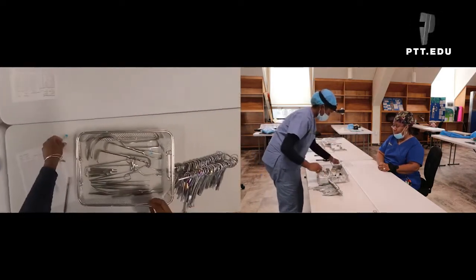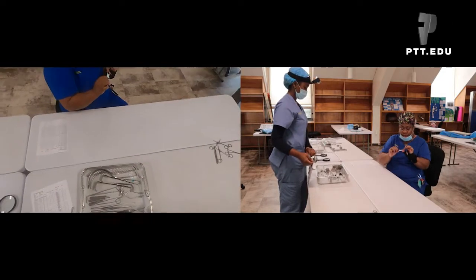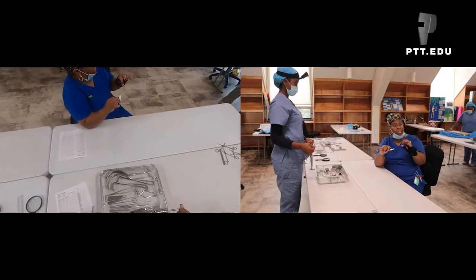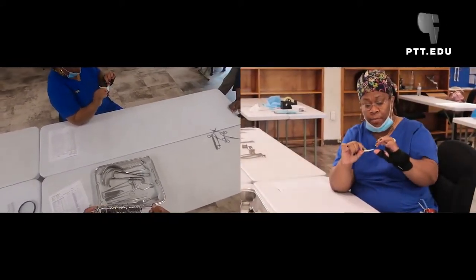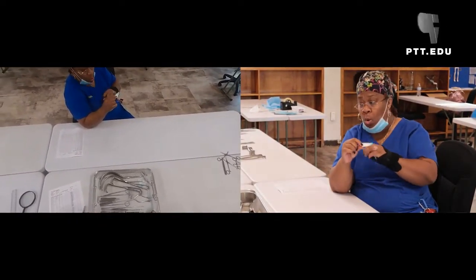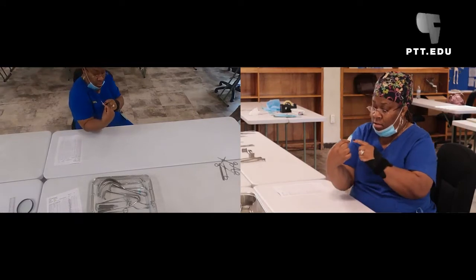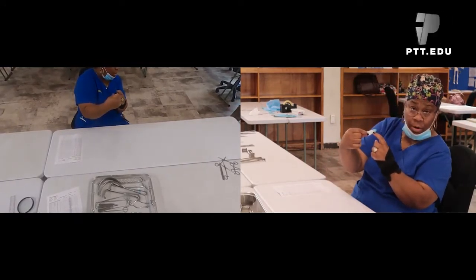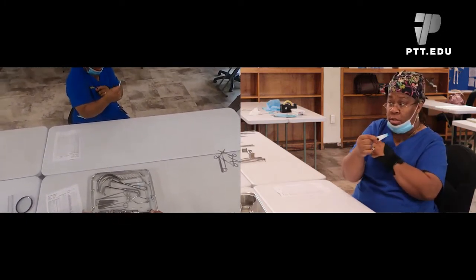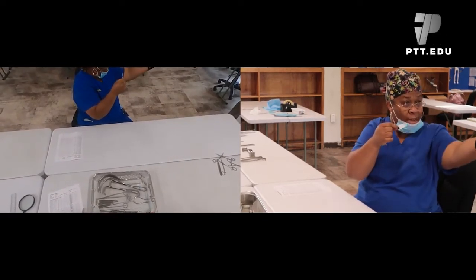And ladies and gentlemen, she's putting in her internal indicator. This little thing right here is so important. They come in different sizes. This tray is meant to go for high temperature sterilization. When they open up this tray in the sterile field in the operating room, the first thing that they're going to look for is this little indicator here. See, right now this little white window is clear. It means that it has not been sterilized. The first thing that the surgical tech is going to look for is to make sure this little window is black as your sweater.